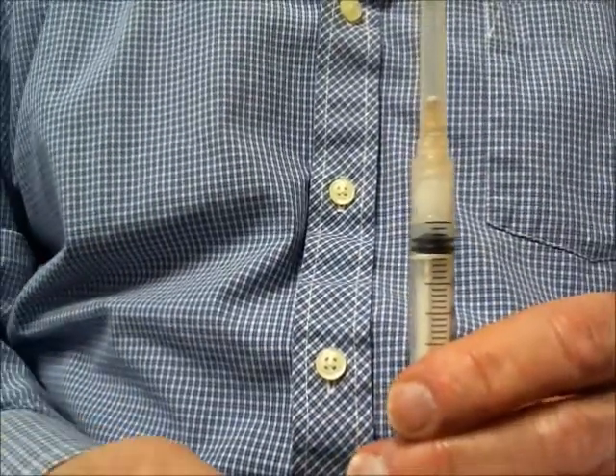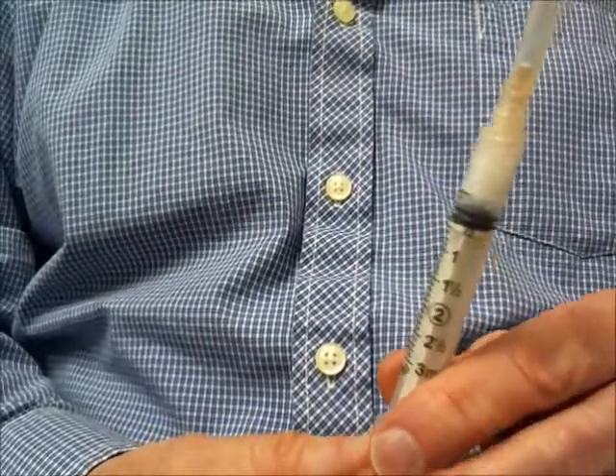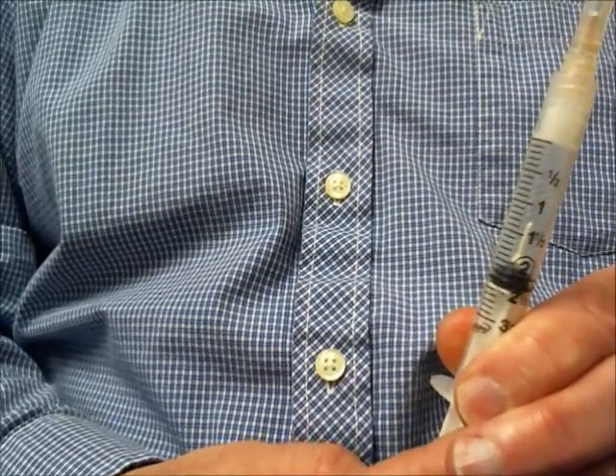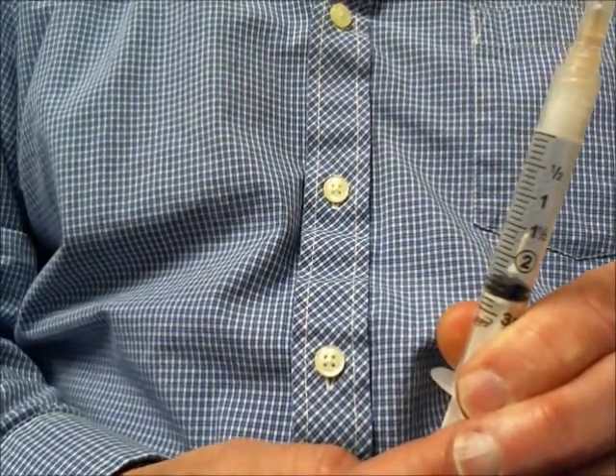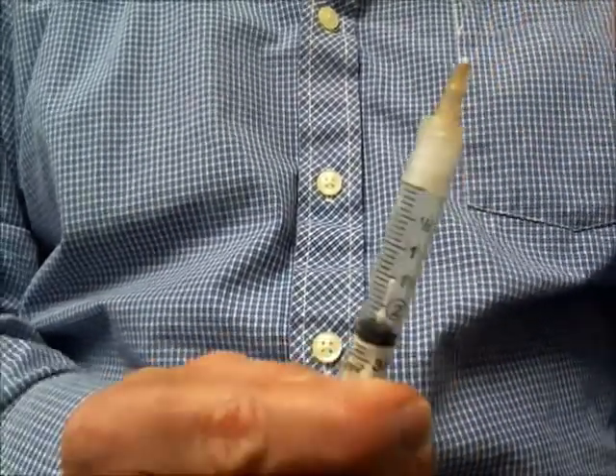For this demonstration, I am going to draw up two cc's of fluid. Prior to going into the vial, I am going to pull the plunger back to get some air into it, so when I go into the vial, that air will displace the fluid that I am going to remove from the vial.